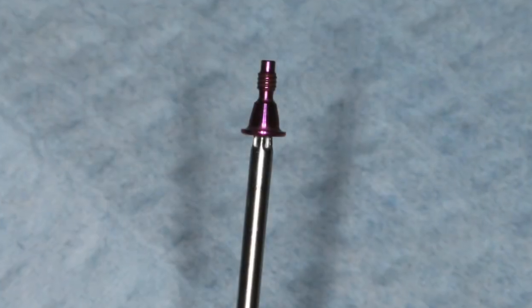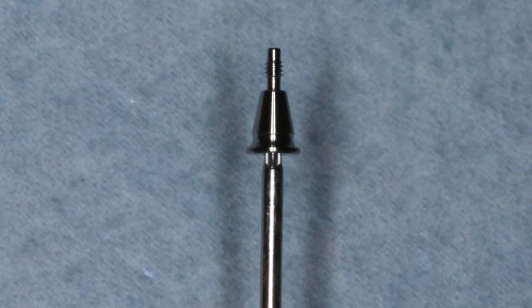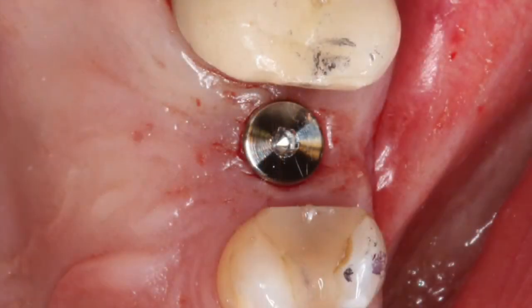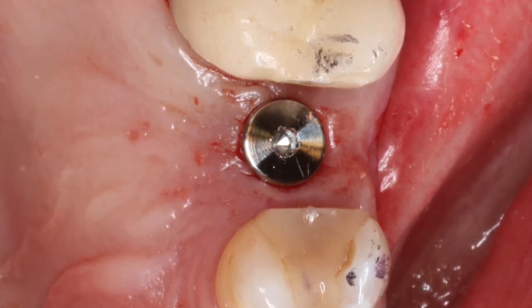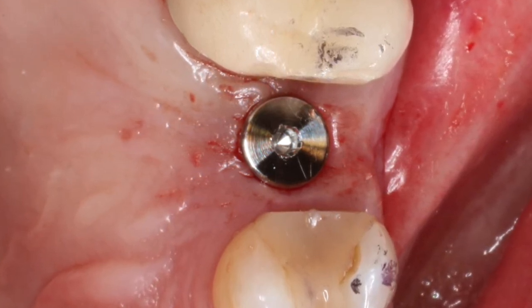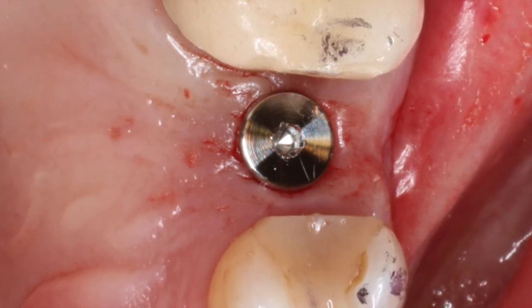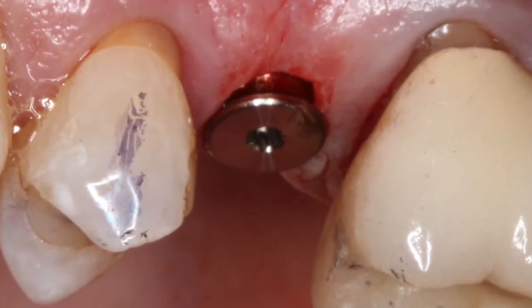Here we have a closure cap. Because we got to 45 newton centimeters of torque — a tremendous torque — we can use a taller healing abutment. The healing abutment is a wonderful instrument because it eliminates the second stage surgery. It will penetrate through the soft tissue, and the soft tissue will heal around it, eliminating the need to expose the implant that we would have to do if we had placed a cover screw and the epithelium was allowed to regenerate over the top of the implant. Taking our healing abutment, immediately post-op we have great attached gingiva and very little bleeding.